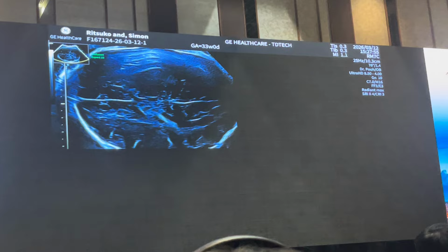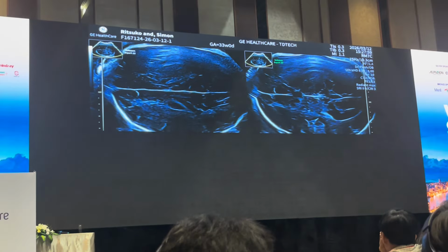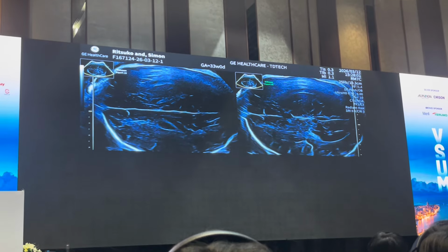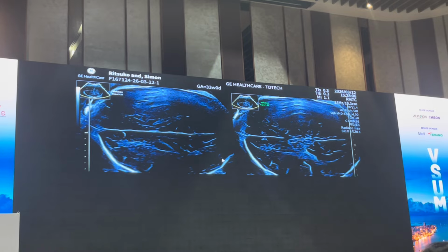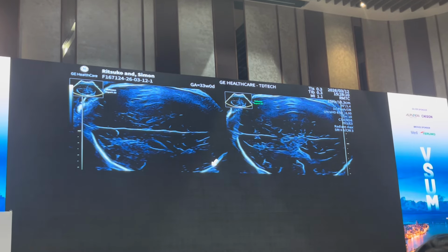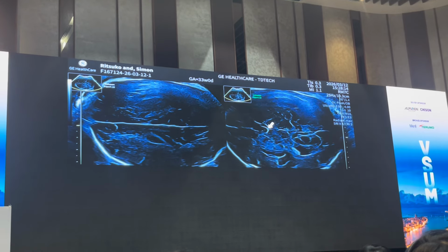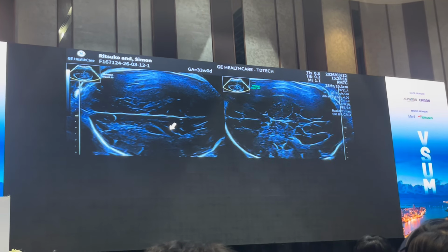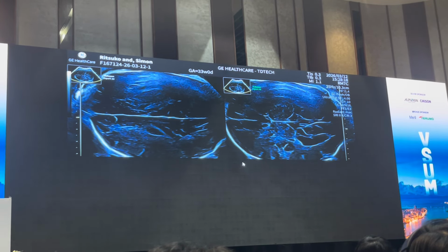I then update my image and come down to the next section, looking at the ventricles. I have an anterior landmark and a posterior landmark. If I can just bring up the pointers and the arrow. I bring up my landmark of the cavum septum pellucidum, and I bring up the landmark of the cerebral lateral ventricles, ISUOG section number 2.